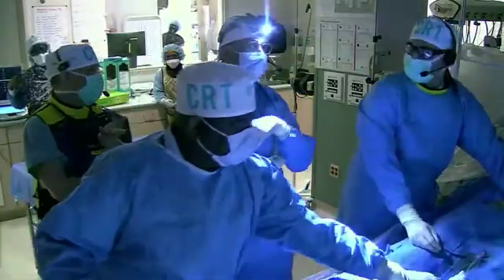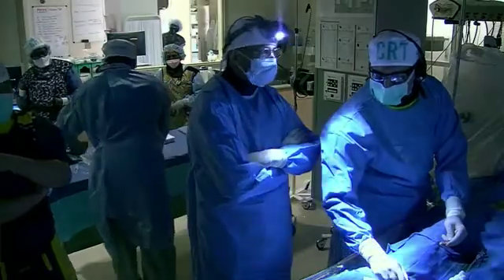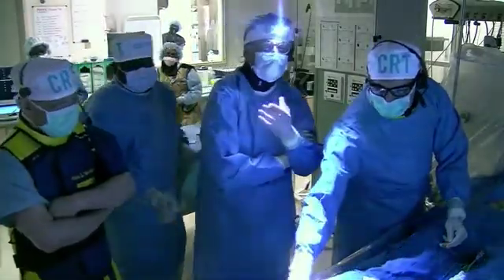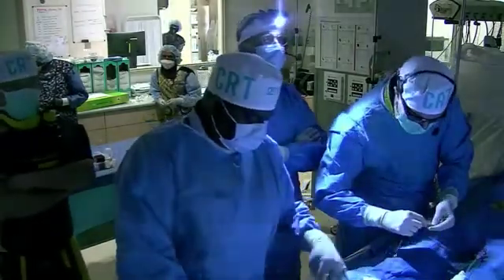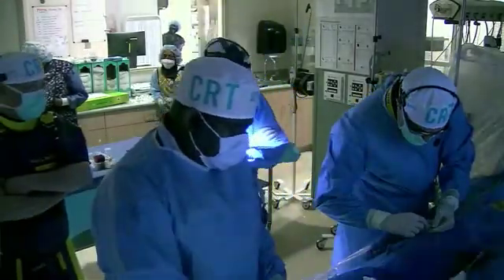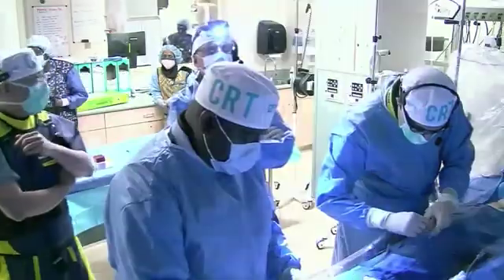If I was here with OCT, I wouldn't be able to inject with the guide extension. I'd have to do a manual injection. Everybody is not happy. Leave it be. Everybody's not happy. I'm happy. Don't forget. Leave it be. This is a part of the unknown. Oh, we can ultrasound here. I just like to keep it simple in the lab, that's all. I can get an IVUS.